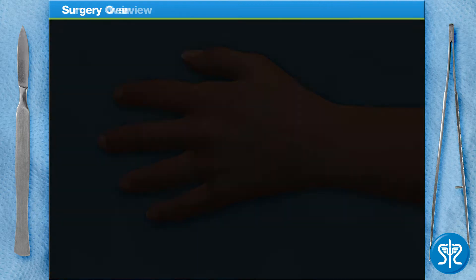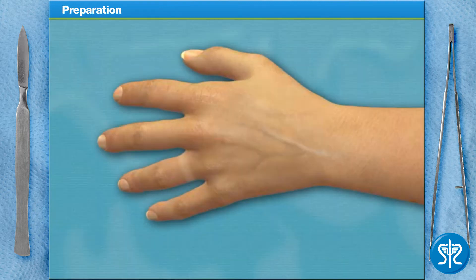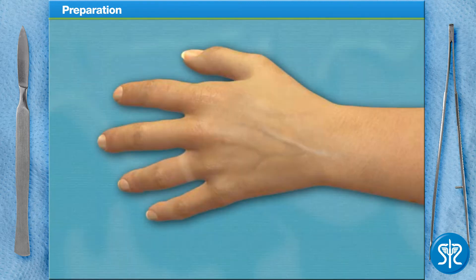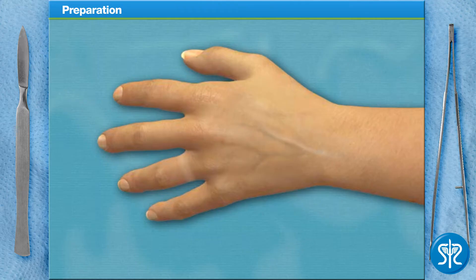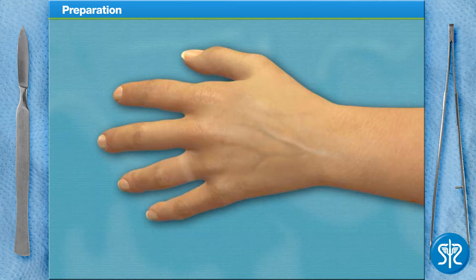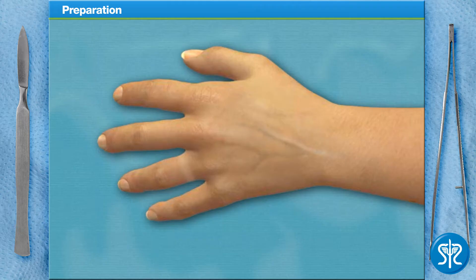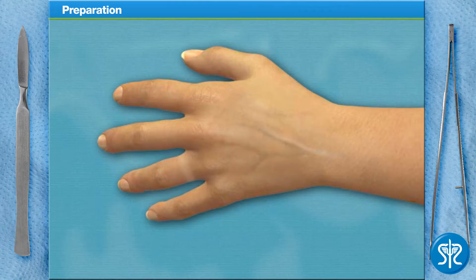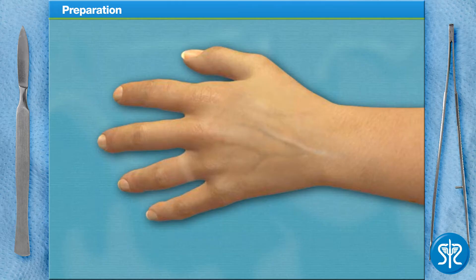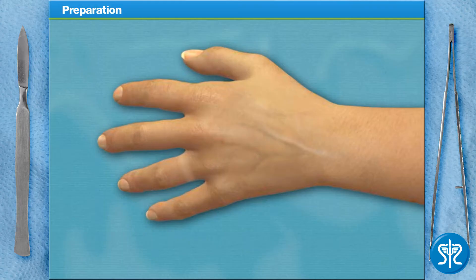We'll begin the procedure by inserting an IV into our patient's hand so that we can provide her with any medication and fluids she may need. I've already tied a tourniquet on the patient's upper arm. Can you find a suitable vein in the patient's hand?